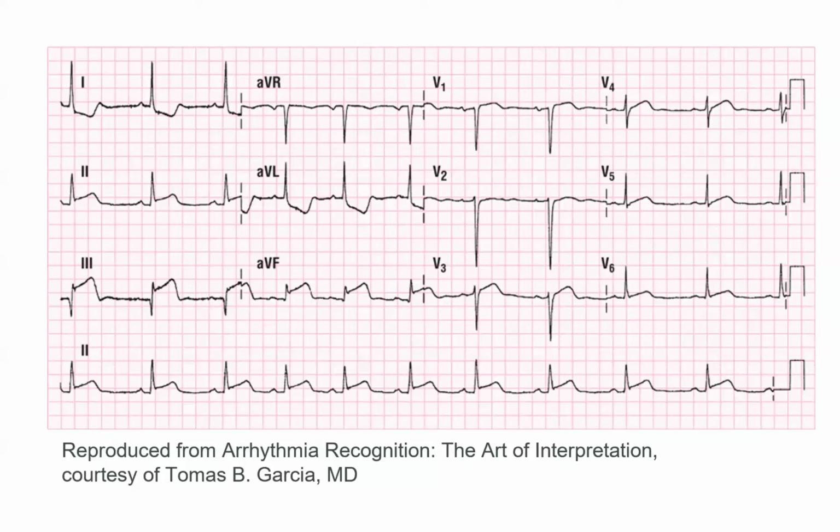So like you said, if you wanna be in the protocol, but say it's like way above, right? And then you're saying that you need to check the right side before you would do anything to give nitro, but if it's not within that range, why would you? I hear you. Because I want to confirm what I'm dealing with first. And I want to do it quick. It's a great question. I want to do it quick while we're getting everything ready, we're throwing aspirin. I just want to get that picture. Because sometimes what happens when you move people, when you do things, that picture changes.